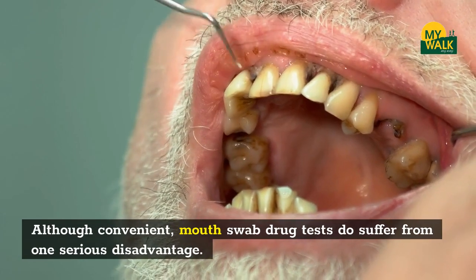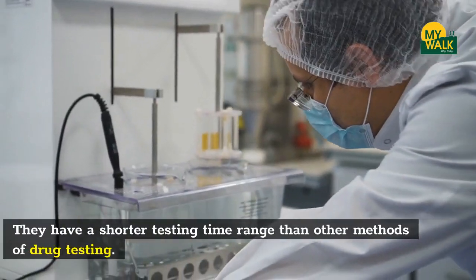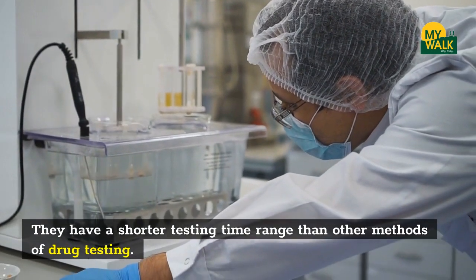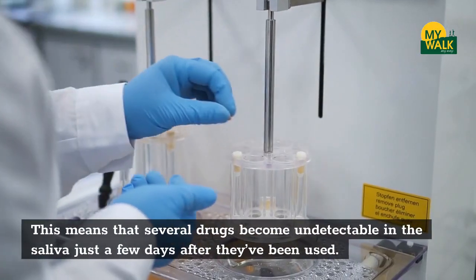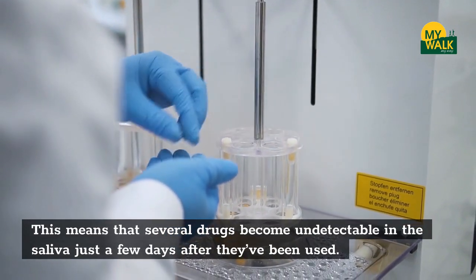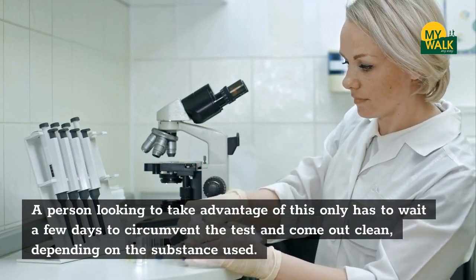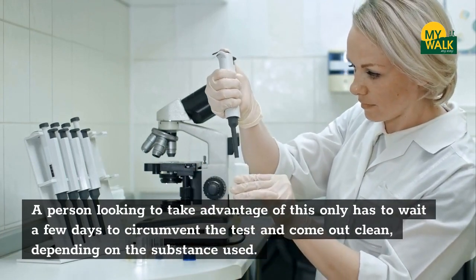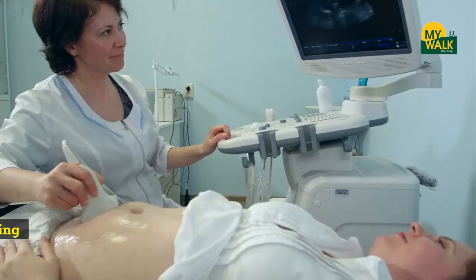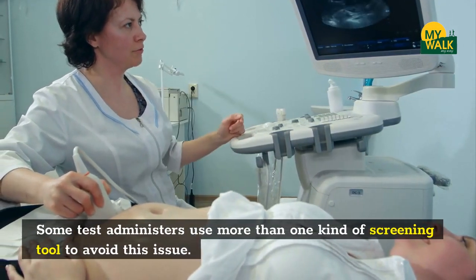Although convenient, mouth swab drug tests do suffer from one serious disadvantage. They have a shorter testing time range than other methods of drug testing. This means that several drugs become undetectable in the saliva just a few days after they've been used. A person looking to take advantage of this only has to wait a few days to circumvent the test and come out clean, depending on the substance used. Some test administrators use more than one kind of screening tool to avoid this issue.